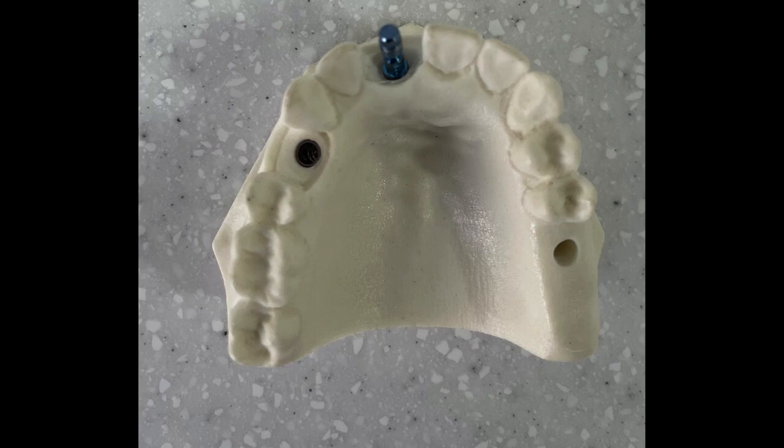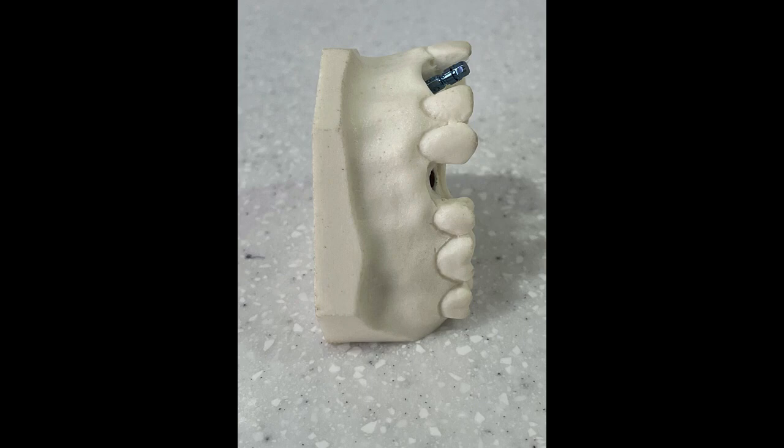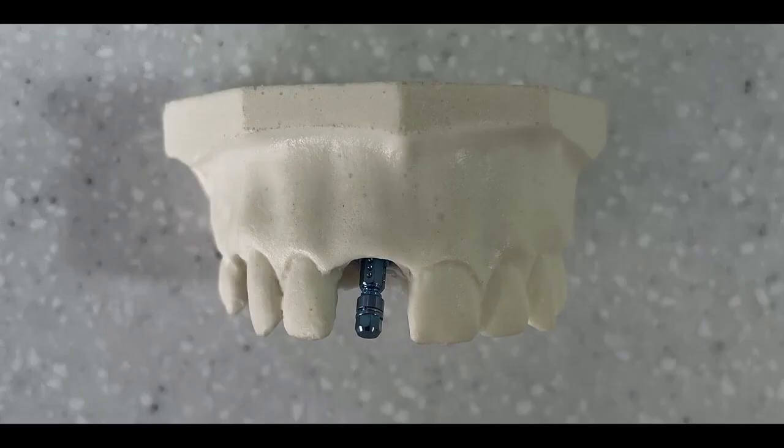and it also allows us to use things like tie bases and scan bodies and scan posts to plan and make our implant restorations. However, every now and again we will come across a case where the implant is suboptimal, as you can see in these pictures here. The placement has not been ideal, the emergence profile is not ideal, it's too far buccally placed, the orientation is too buccal, and the incisal edge again is too buccal, and we can see this from these photos.